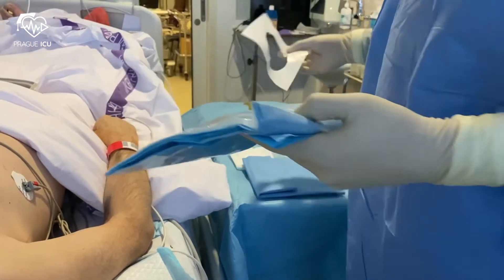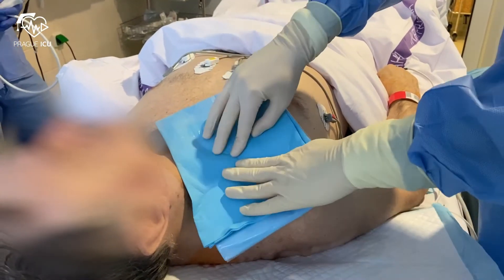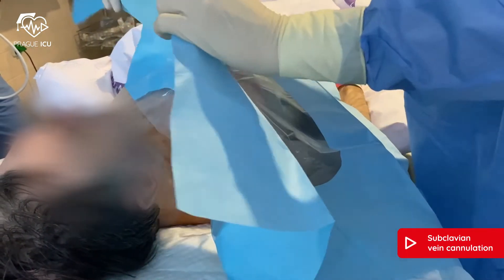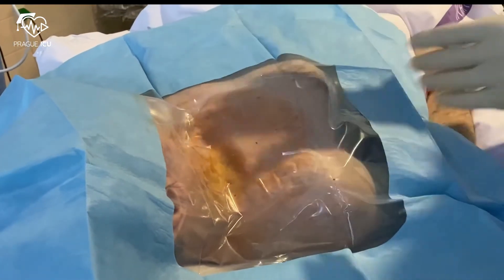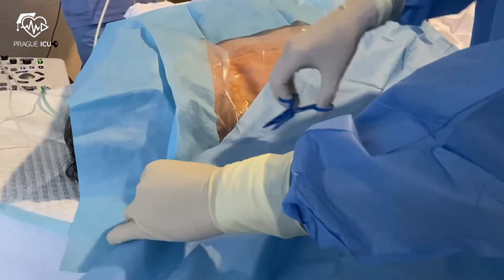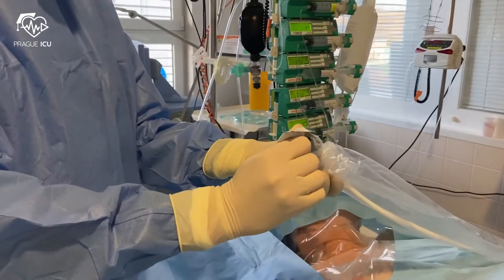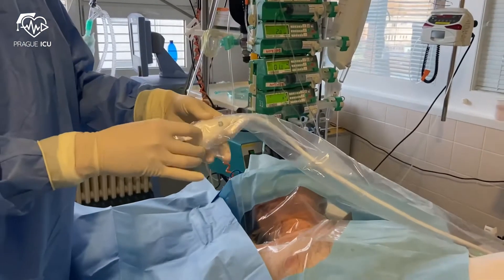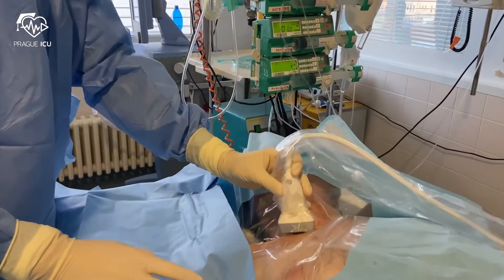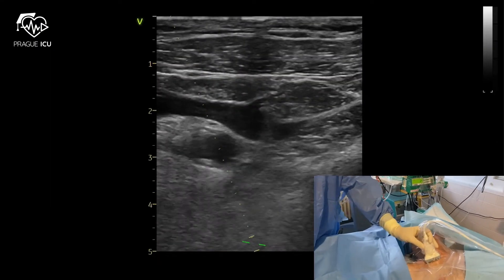Then drape the intended area. Afterwards, insert the ultrasound probe into the sterile cover. Position the probe to have the right side of the image on the right and left side on the left. Check again the presence of the subclavian vein in the longitudinal view, which is preferred over the transversal position for cannulation.